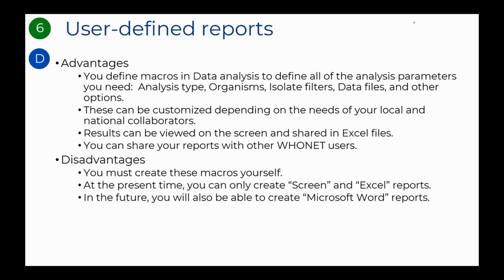There are some disadvantages to the user-defined reports, as you must create the macros yourself. Also, at the present time, you can only export user-defined reports to the screen or to Excel. You cannot create your own user-defined reports for Microsoft Word, but we hope to offer this possibility in the future.